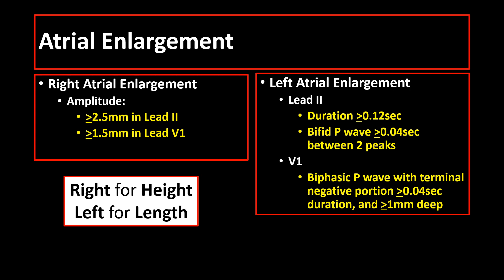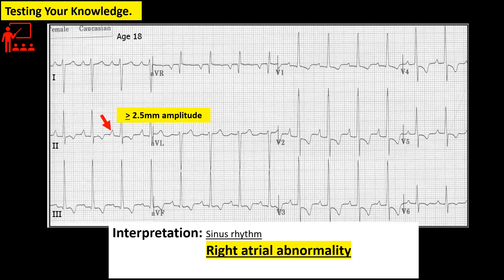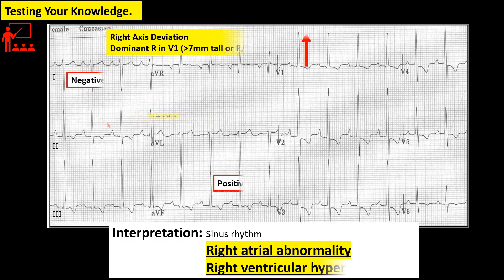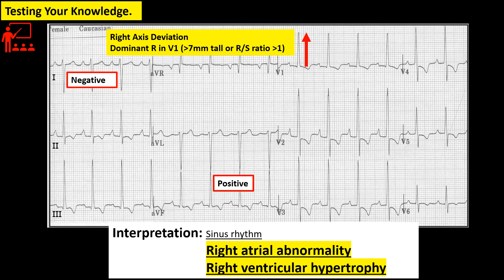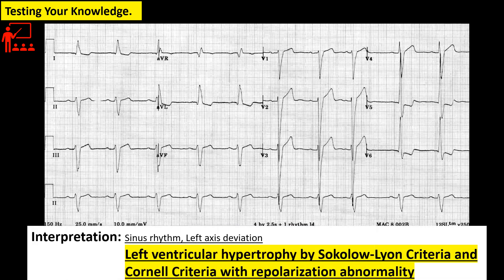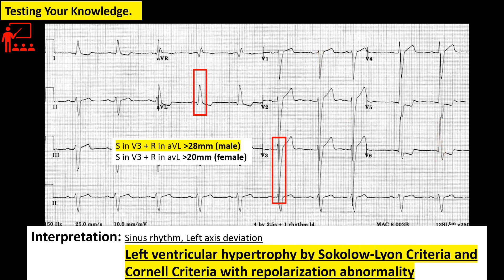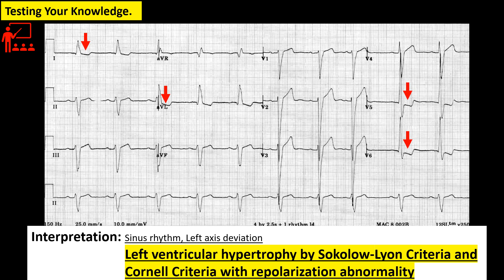Let us apply everything that we just learned. For example, in this tracing, what is your reading? It is right atrial abnormality or enlargement and right ventricular hypertrophy. How about this tracing? What is your reading? This is left ventricular hypertrophy by Sokolow-Lyon criteria and Cornell criteria with repolarization abnormality.